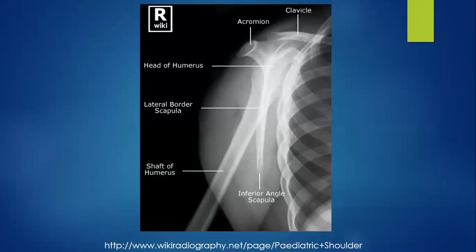And that's what it looks like. So here's our acromion, the back part of the scapula. And you can kind of see this part over here coming up, not the clavicle, but the coracoid process over here. That's the V part of the Y. Oh, here it is. Sorry, I was tracing the wrong bone. And the scapula, this corner is the inferior angle, and the humerus coming down.